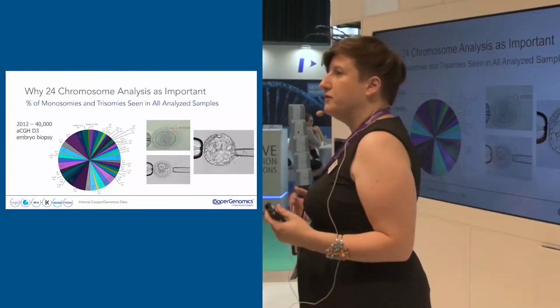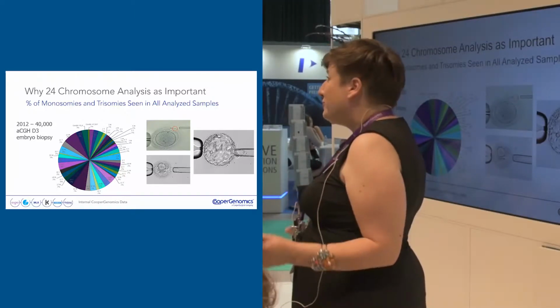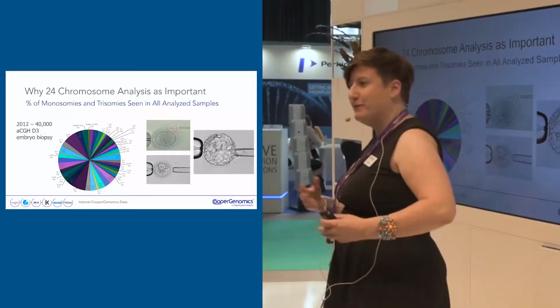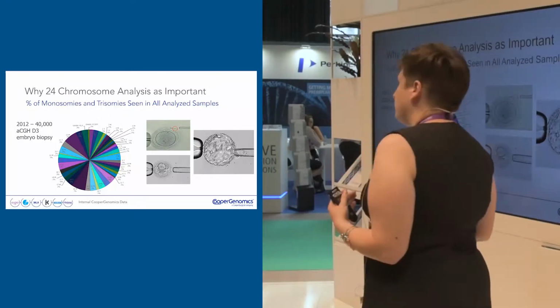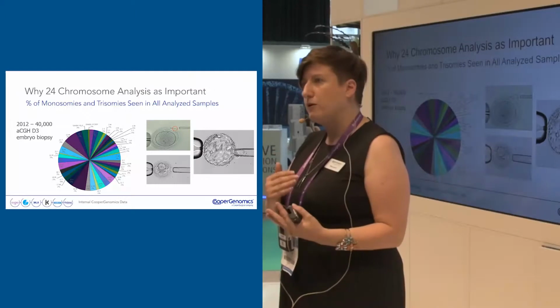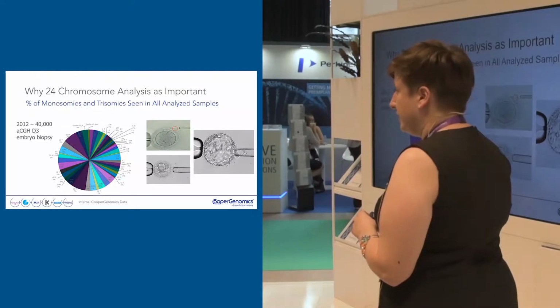And again, it's one of those situations where people say, well, why did you do polar body? Why didn't you do trophectoderm? Because we weren't very good at making blastocysts 10 years ago. We would get blastocysts, but we had a lot of embryos that wouldn't develop to that stage. So once people improved their culture systems, we got better incubators, we got better culture systems, we were then able to move to biopsy at the blastocyst stage.